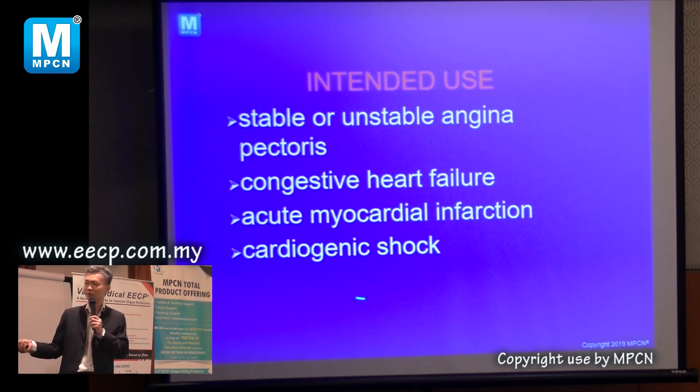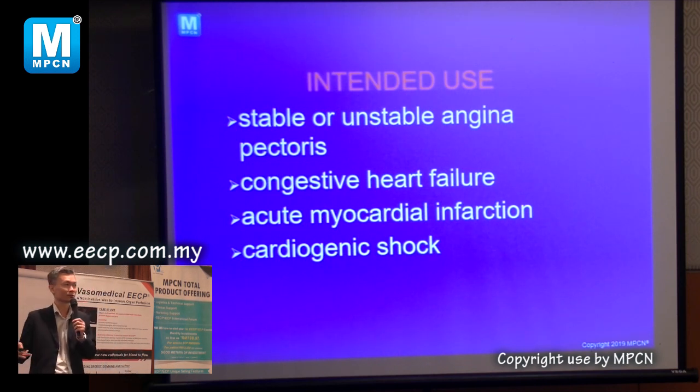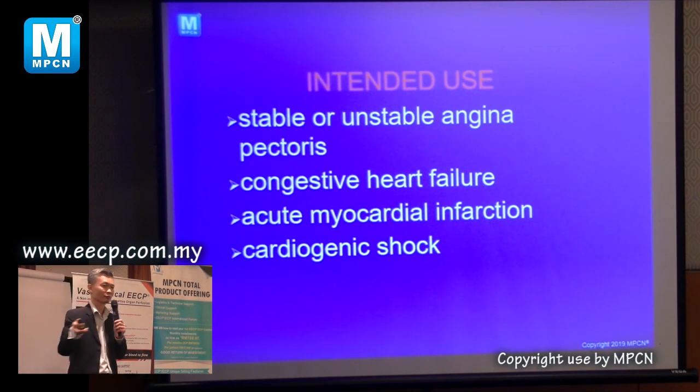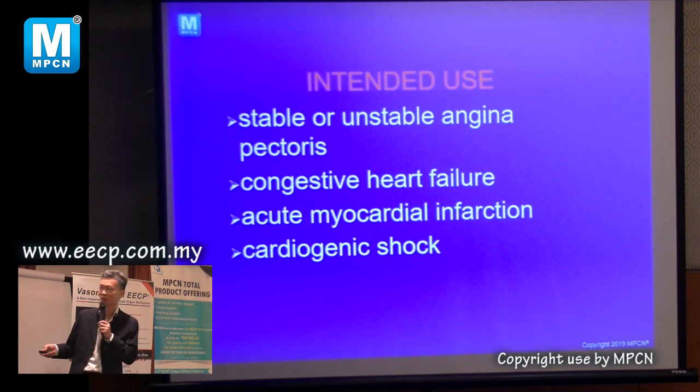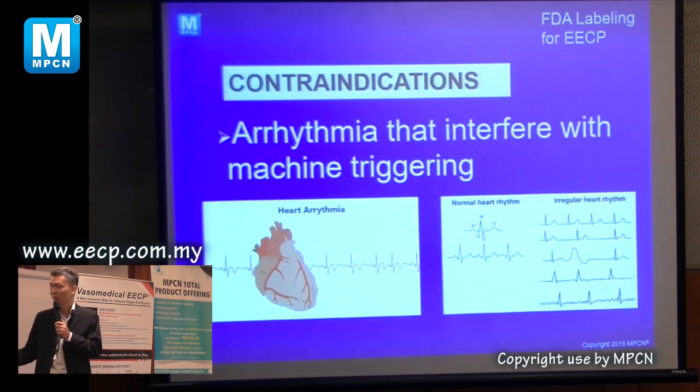And patient with cardiogenic shock, you use an invasive one because it's more consistent, because we can use it for 3 to 5 days. If you use a pump, you cannot pump for 4-5 days, not possible. But the invasive one, we can just leave it inside and then pump. So we don't use it for EECP. So this one is the most common. This one, you have to be careful, but this one is rare. This one is also not practical.